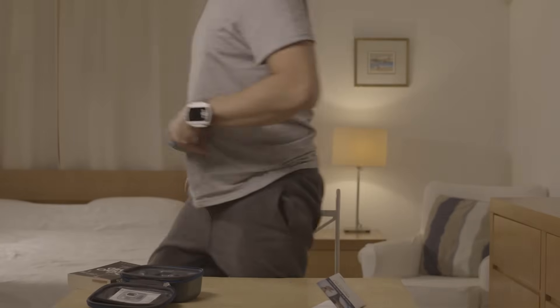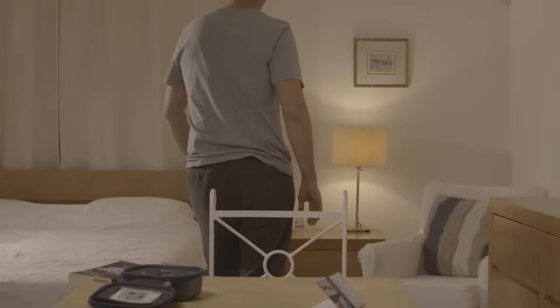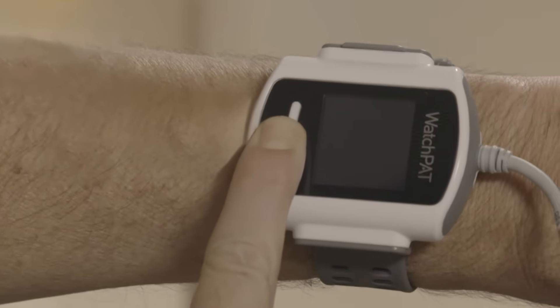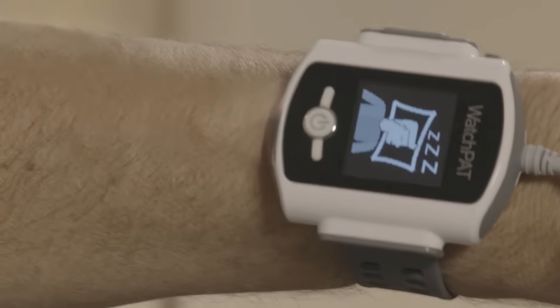You are now ready to turn the WatchPAT on. Get into bed. Press firmly on the power button until the display lights up. After a few seconds, the good night message will appear. The display will turn off after a short period.